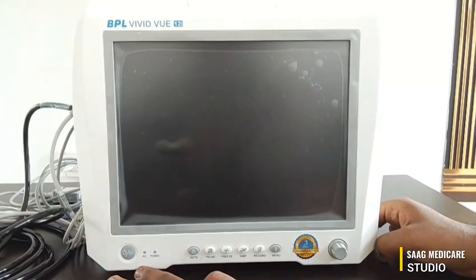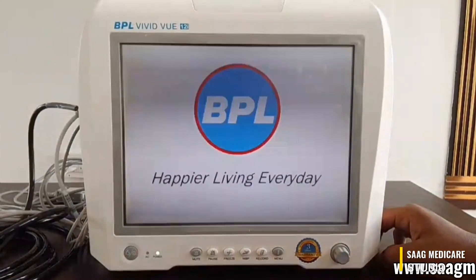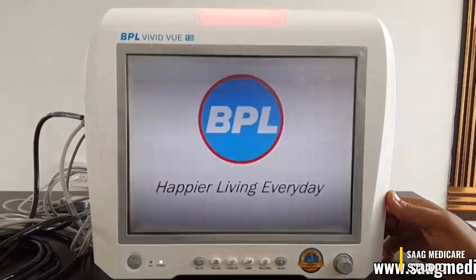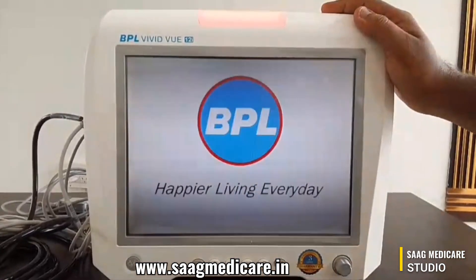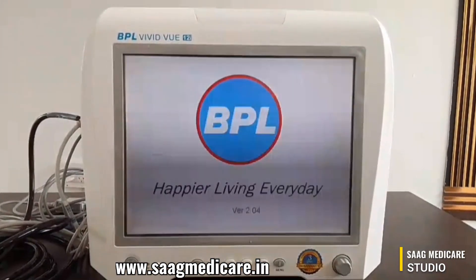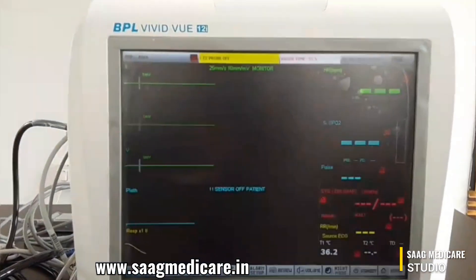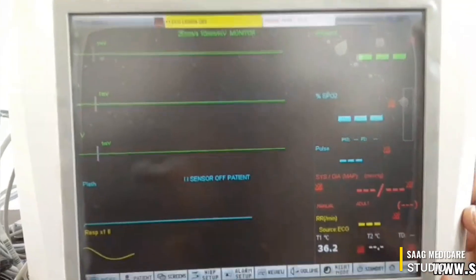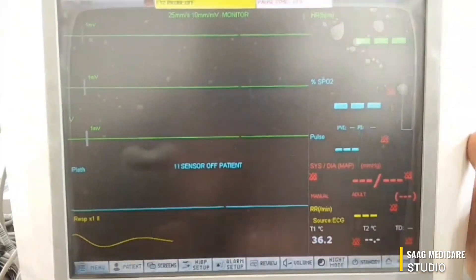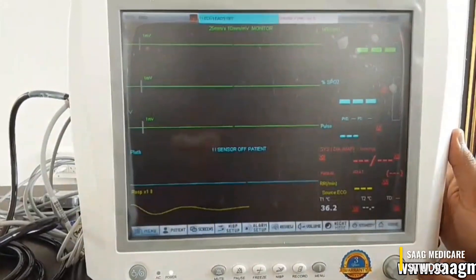To power on the device, just press the power button. As you can see on the display, the BPL logo appears. Wait for a few seconds for it to turn on. This is the main display. You can find parameters like heart rate, SPO2, pulse, and respiration rate. At the bottom side you can find the menu option, patient option, and screen option. On this side you can see the waveforms.